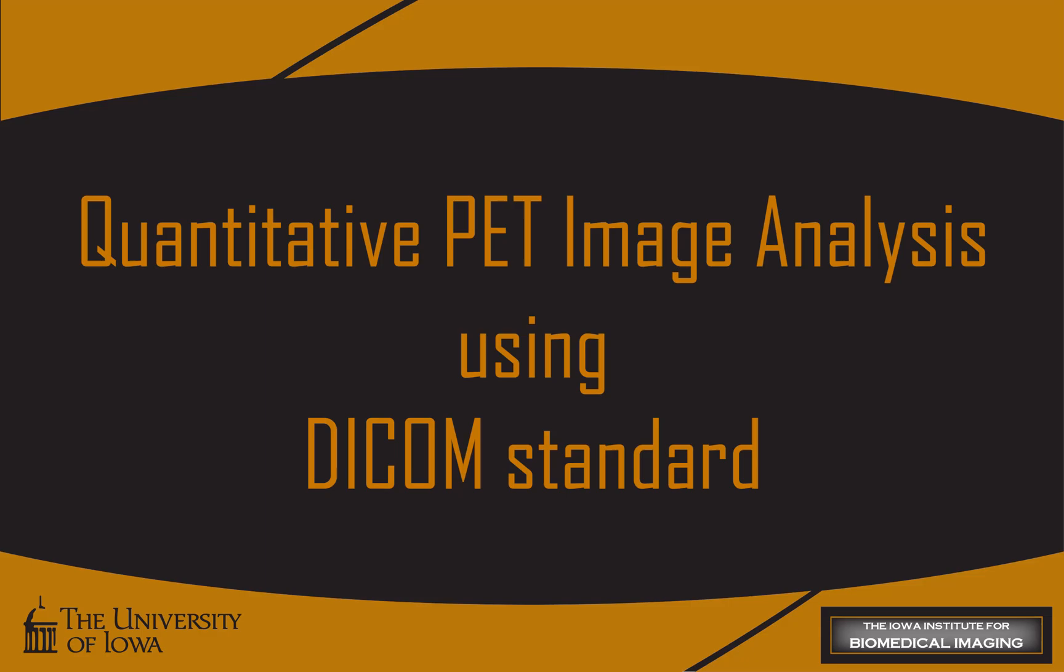This video takes a look at the quantitative analysis of tumors in PET scans with exported DICOM SEG and SR files.